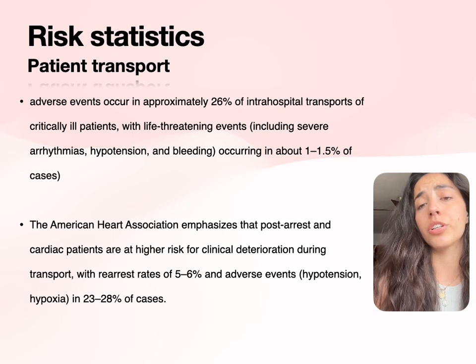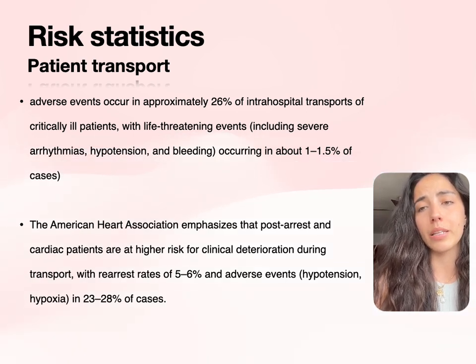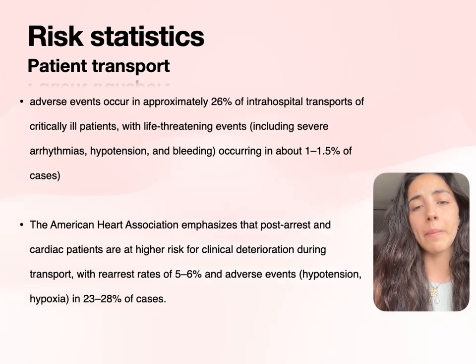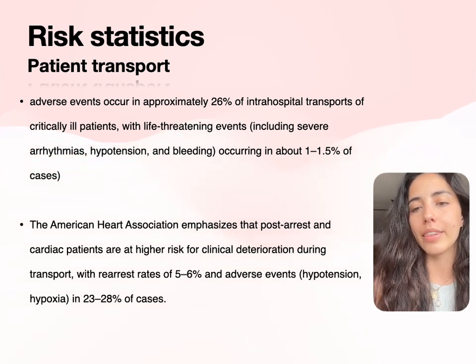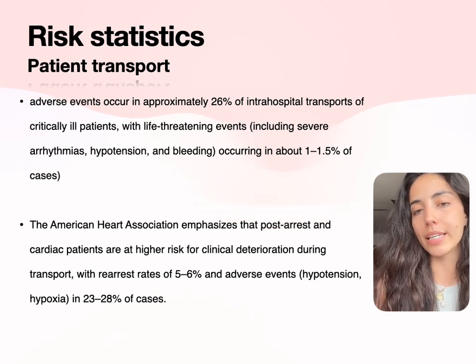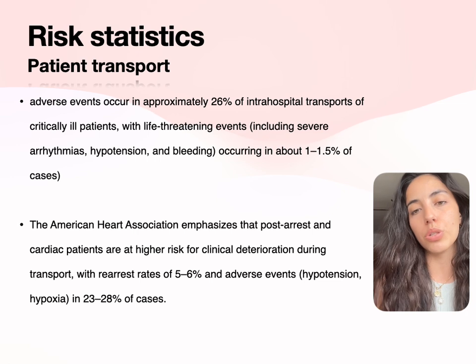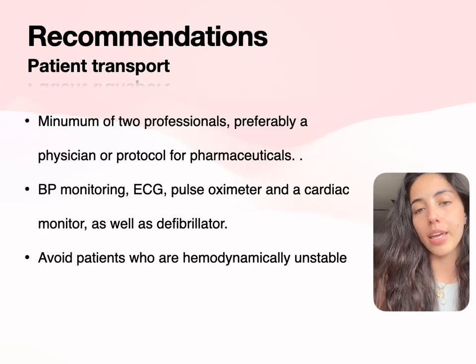In a patient undergoing transport, the risk is usually associated with a decline in the patient's status or accidents related to patient monitoring, and therefore it's important to have a patient adequately monitored to the best of our ability. And this is why electrical cardiometry is a very good option, because it can allow us to gain insight into a patient's hemodynamic profile without needing all of the usual logistics and invasive measures that would not be feasible within the context of transport.